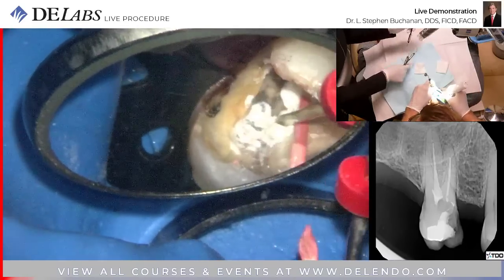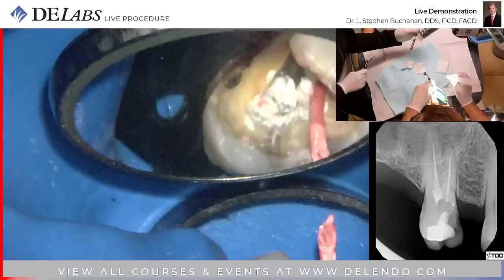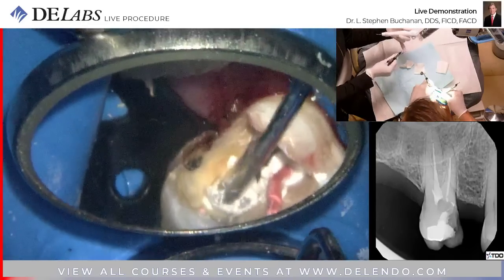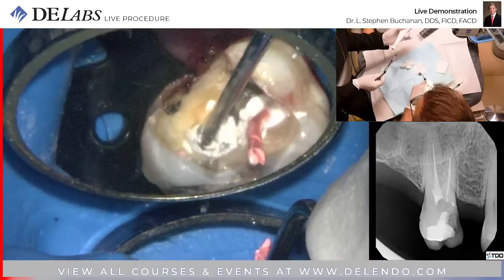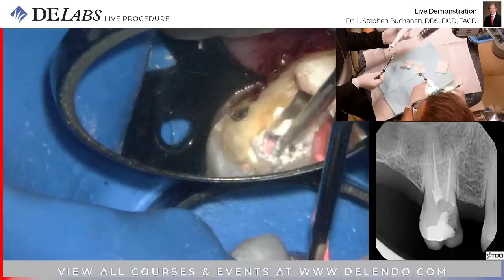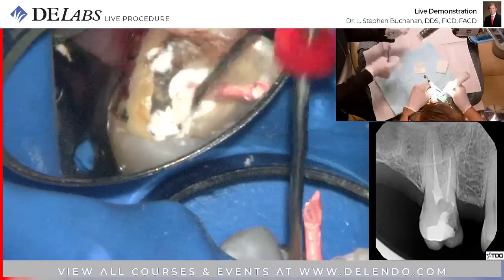Okay, just adding heat, not condensing or down packing. We're going to do a sustained condensation force. Distal buccal.